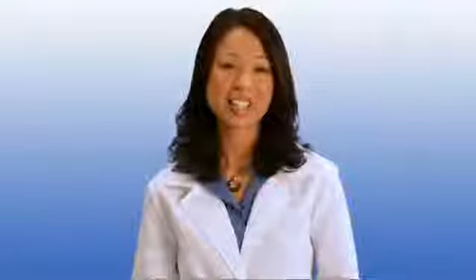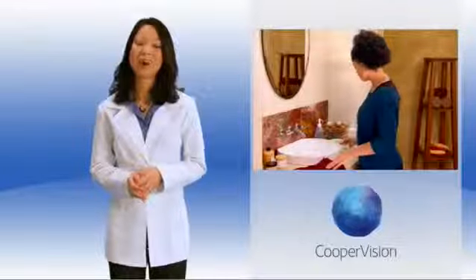As a helpful suggestion, we recommend that you always apply and remove your contact lenses in the same order. This will help eliminate mix-ups or confusion. Always start with your right eye when inserting your lenses.